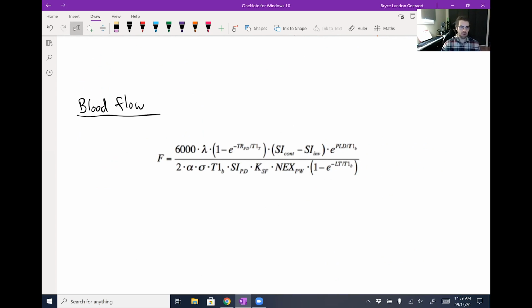Blood flow is dependent on many factors, like the region of tissue, the specifications of the scanner you're using, and the model you've chosen to represent blood flow in the brain mathematically. All these things get added together in a proprietary fashion that differs depending on whether you're on a GE, Siemens, or Philips scanner.